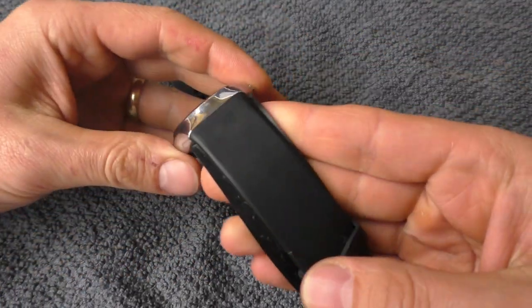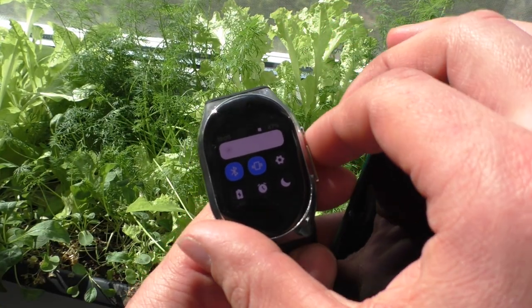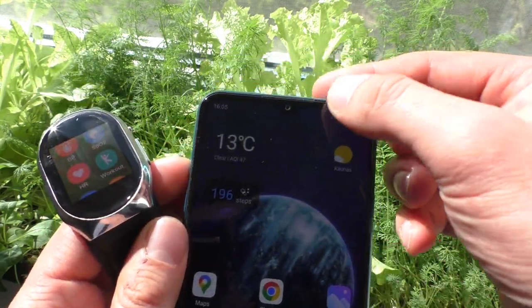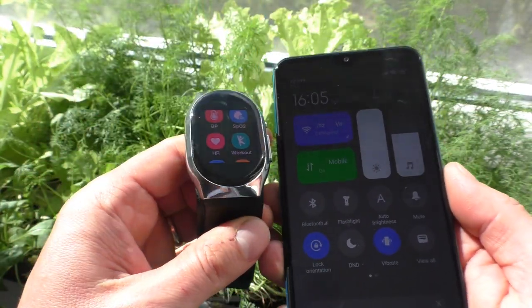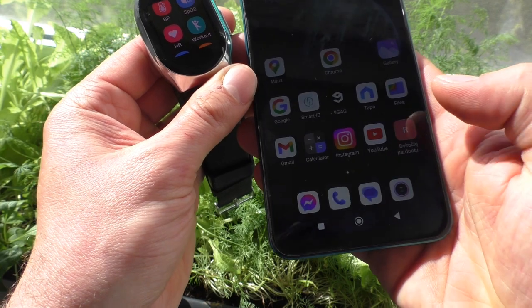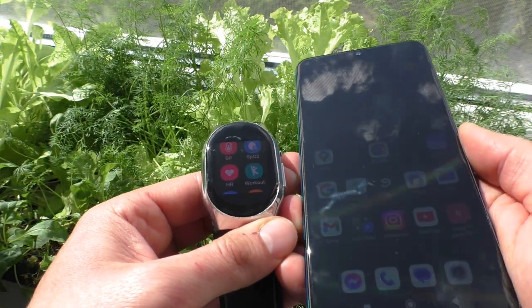It does feel very comfortable on the wrist. Brightness of the screen is very good. Let's set it to max and compare it to my phone also set to max. As you can see, the watch has an even brighter screen than my phone, which is very nice.